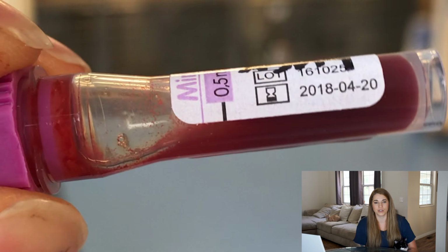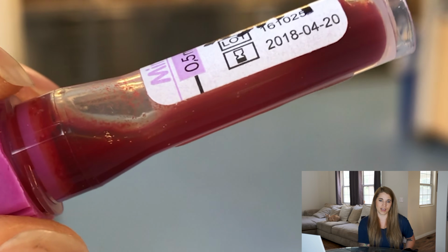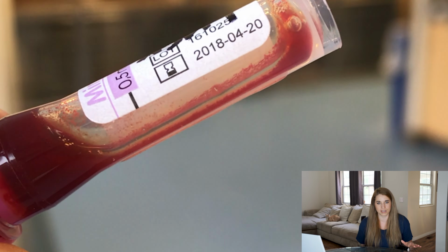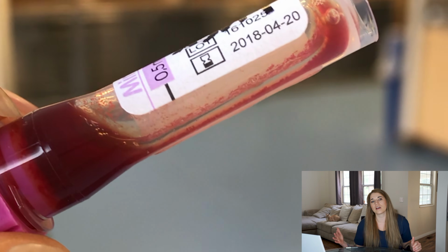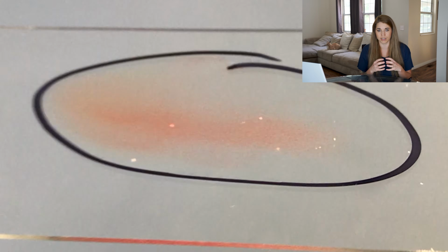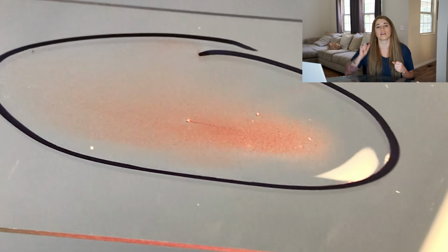You can see severe macroscopic agglutination in the tube, but you should always put it on a slide and make sure that you confirm it there so you don't have any false positives or false negatives. So take a couple of drops of the crossmatch solution, invert your tube, take a couple drops of it, put it on a slide, and slosh it around and look to see if you can macroscopically see these red blood cells sticking together. If you can, do not give your transfusion.